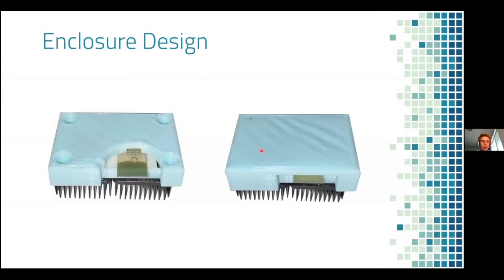The goal of the enclosure is that we can simply put in the blood chip, have it have great contact, and then we have this indent here such that a thumb can go in with some blood, put in the blood, and then we have this Lego-like design such that we can then cover it, shown here.